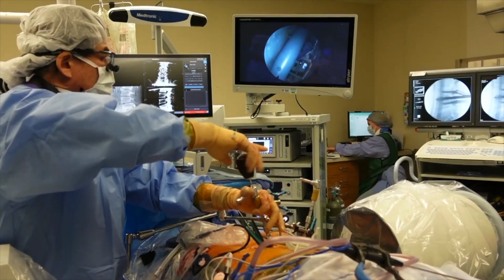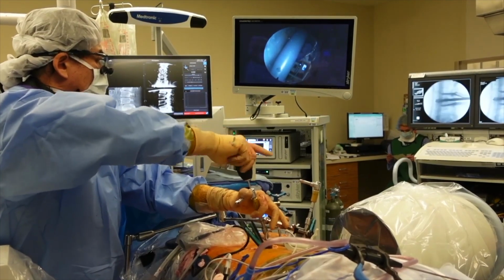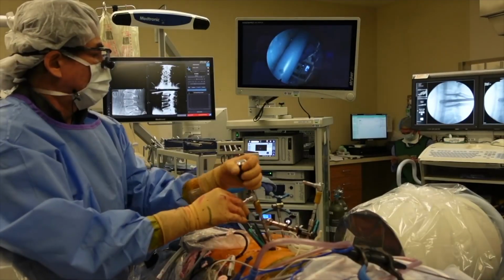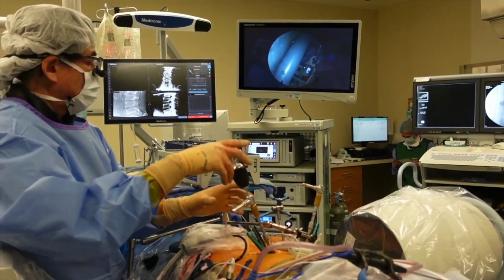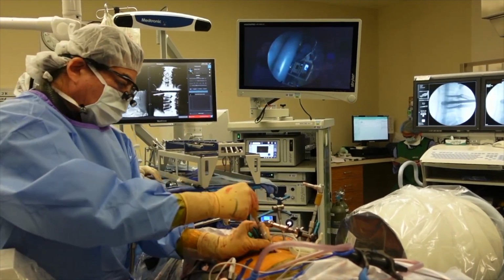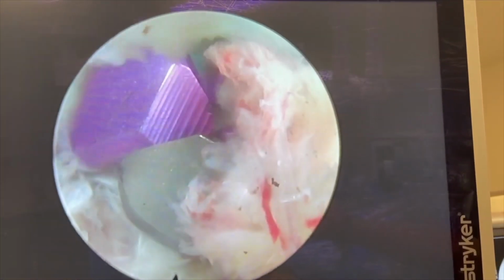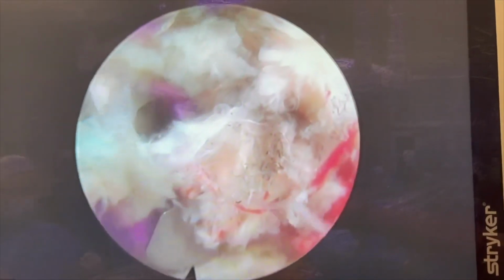Shot and save. Shot and save. I can feel the end plate now. Shot. Oh yeah, it's rotationally very stable. Perfect. That's the bullet nose. That's one end plate. The other end plate is right there. I'll get rid of all that other stuff. I like these long old time stuff.